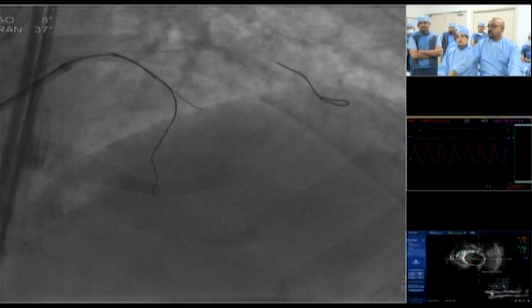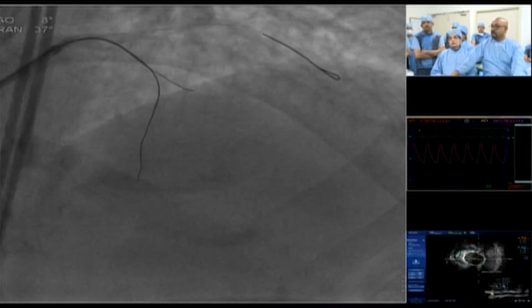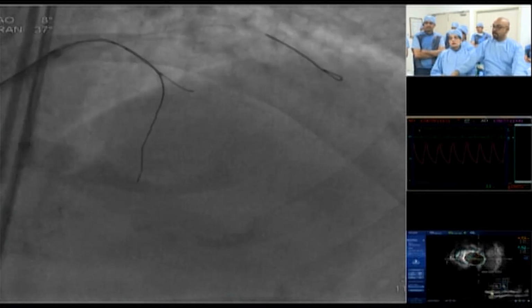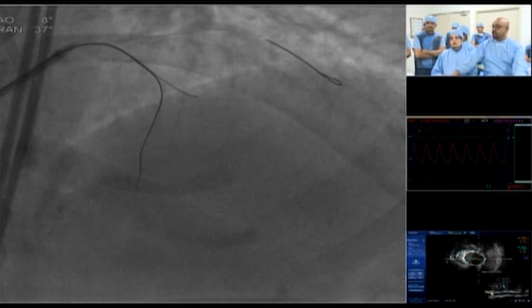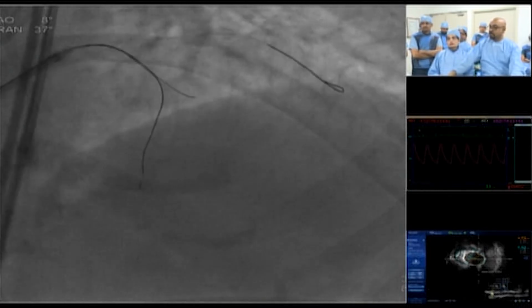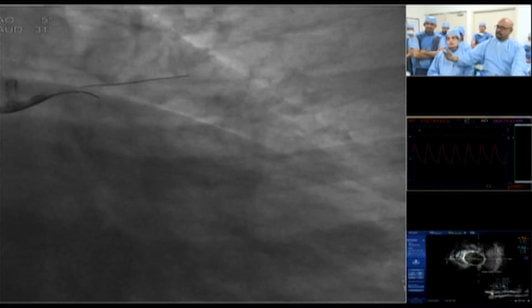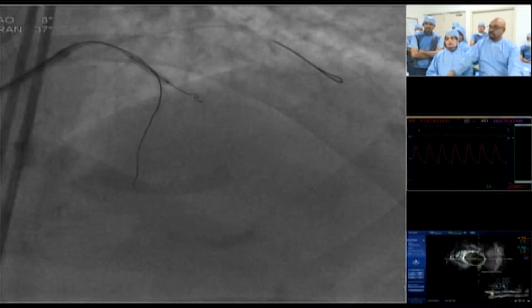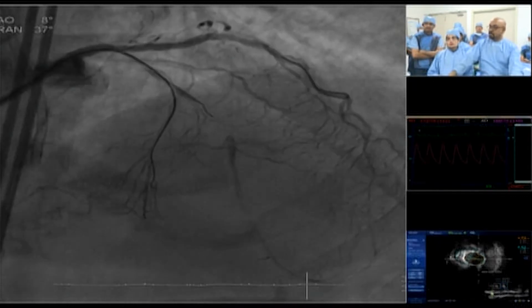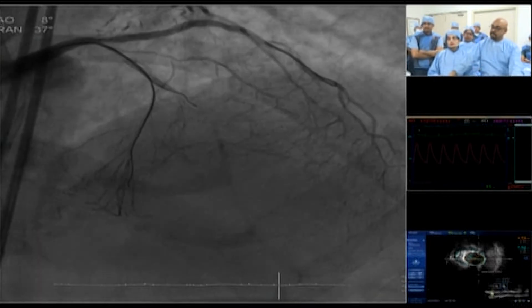So I decided to first secure the septal because that's the key for the RCA right now, and any manipulation in the LAD should not close off the septal. So I wired the septal with the Fielder XT. Initially we tried with the Whisper. We did not cross, as there is an ostial disease in the septal also. So I placed a wire in the septal and took another wire to go into the LAD and dilated the proximal LAD, because if I take a microcatheter through that critical lesion in the LAD, it's going to cause a lot of ischemia, and the RCA territory is going to get ischemic.